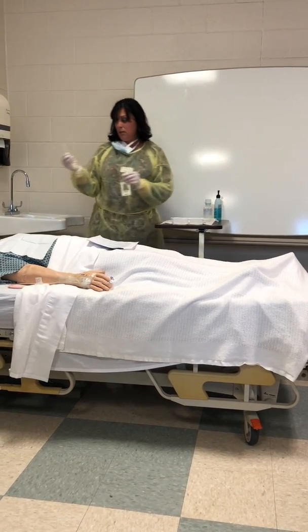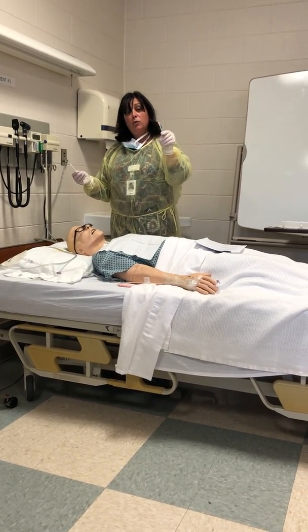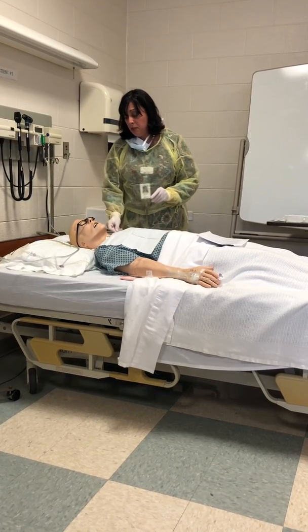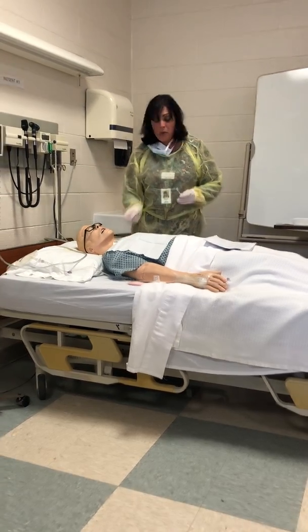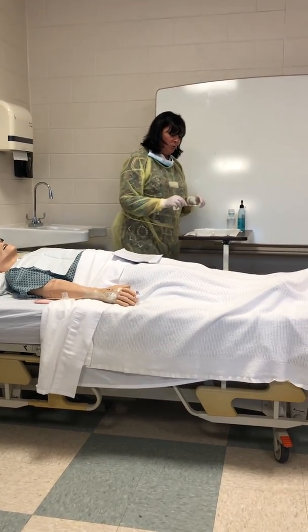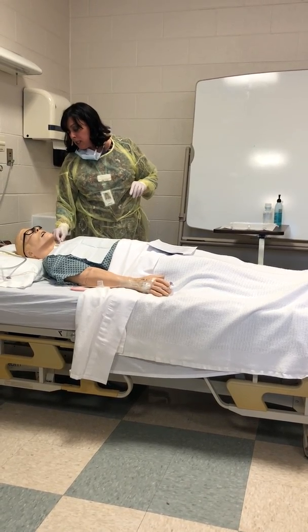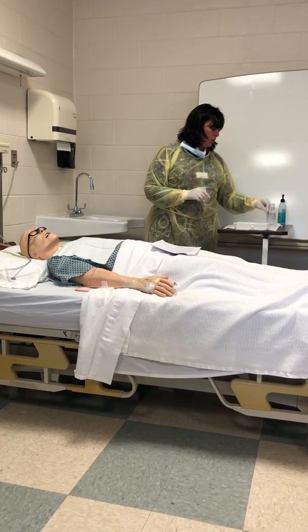Peroxide and saline. So you go underneath of the faceplate, and you wanna do it in a rolling motion and get all the way around. Roll around. Oh, that's bubbling. So I'm gonna wipe it off with the saline or sterile water. Good. I got one left. Peroxide it. Roll it around. Get all that clean. Oh, he's bubbly.